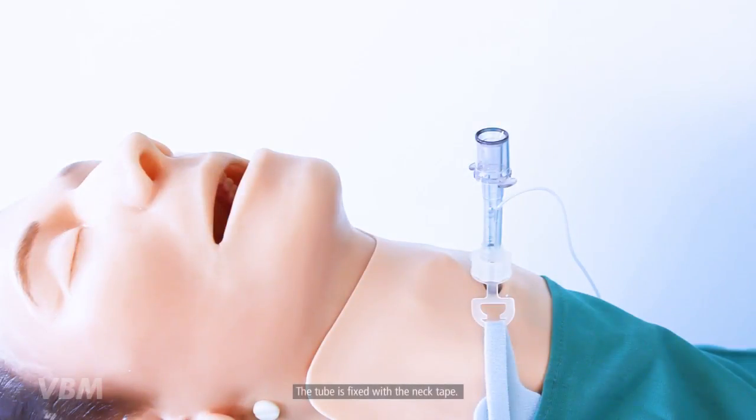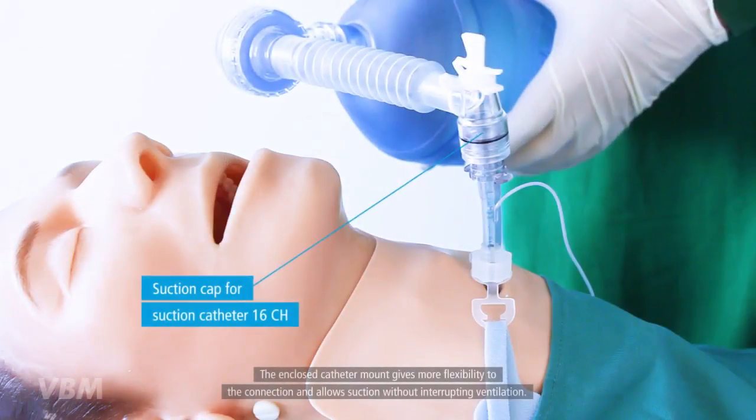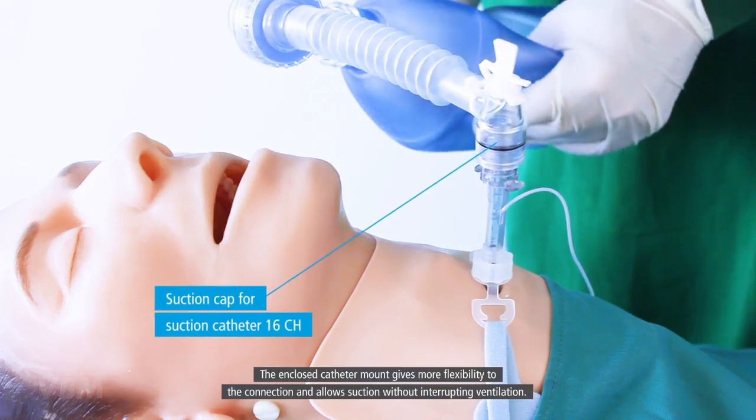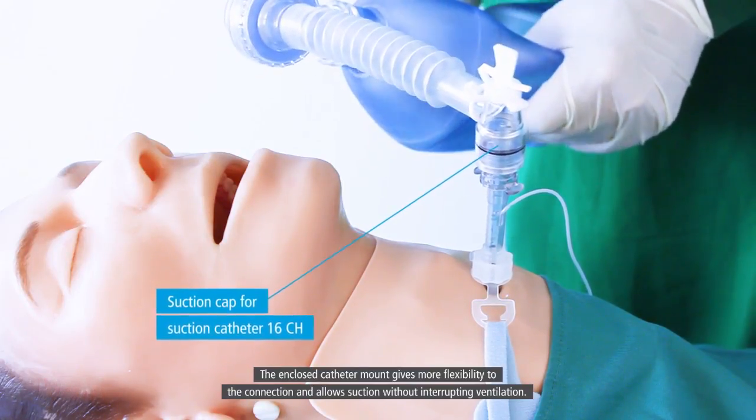The tube is fixed with the neck tape. The enclosed catheter mount gives more flexibility to the connection and allows suction without interrupting ventilation.